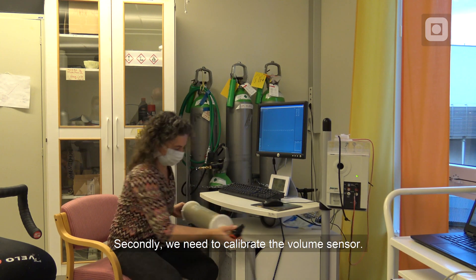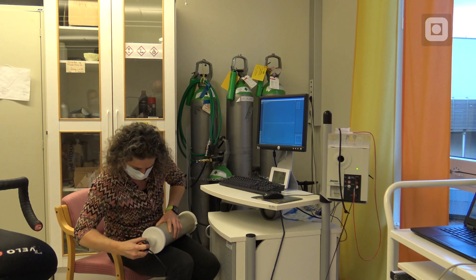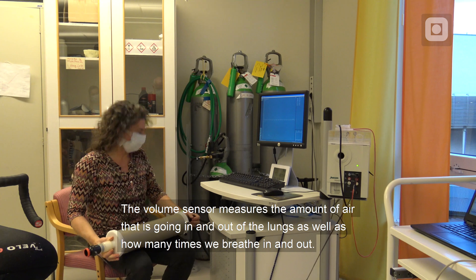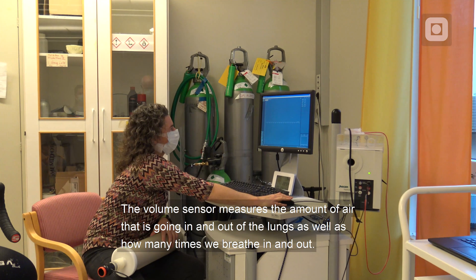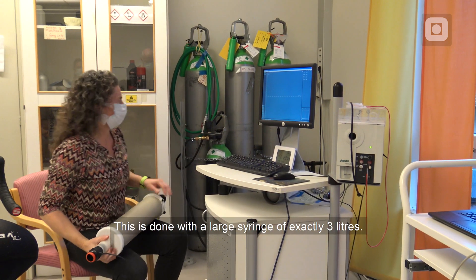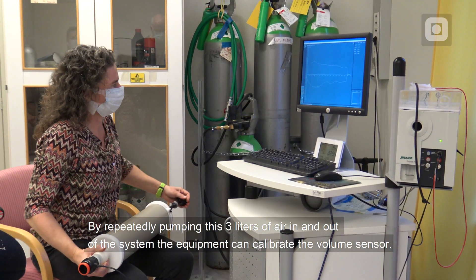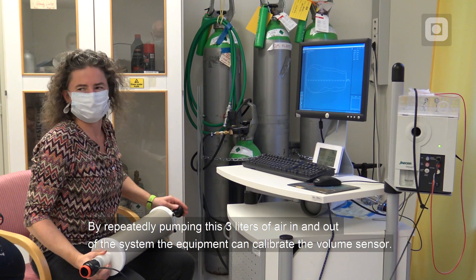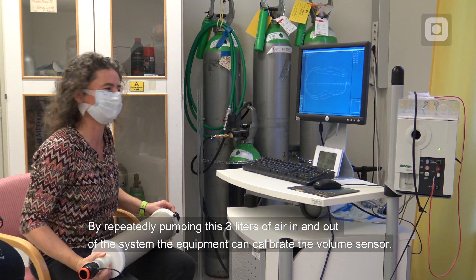Secondly, we need to calibrate the volume sensor. The volume sensor measures the amount of air that is going in and out of the lungs, as well as how many times we breathe in and out. This is done with a large syringe of exactly 3 liters. By repeatedly pumping these 3 liters of air in and out of the system, the equipment can calibrate the volume sensor.